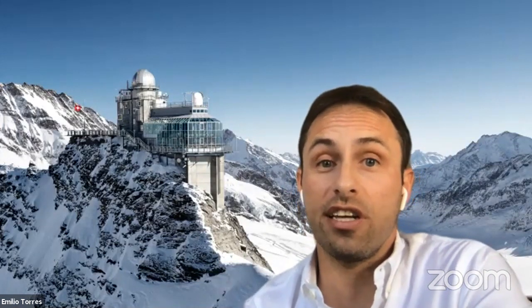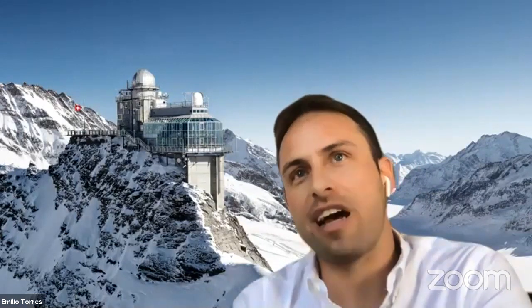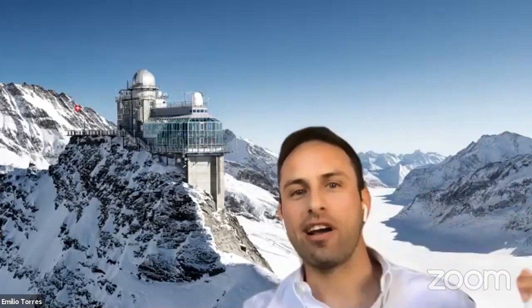What we would like to see is a normal epithelial profile. So this would tell us the cornea probably is not progressing. But as I said, this is very controversial. What I mentioned in the presentation, a tool that I'm sure all of us would like to have, is a tool that when the patient comes the first time to the office, we could say to the patient, okay, you are progressing, or okay, you are not progressing. And we don't have this tool so far.